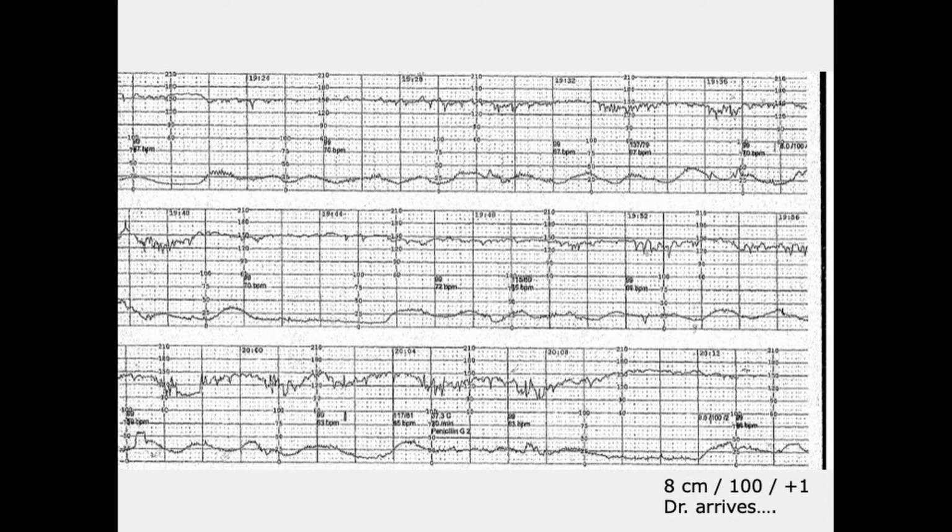The variability that's in between, when we have a normal fetal heart rate, that's signaling that our parasympathetic and sympathetic nervous systems, which work in coordination with each other, are balanced. We're not having a physiologic response to stress. We're working the way we're supposed to. We're not trying to survive in between. We're thriving. During a decel, we're just trying to survive. All right.